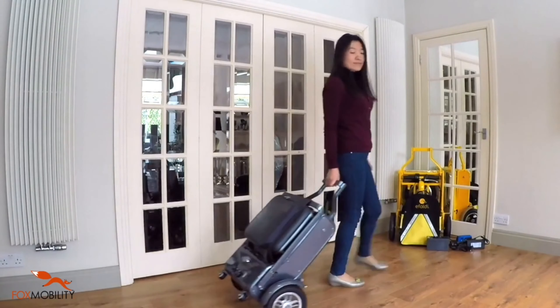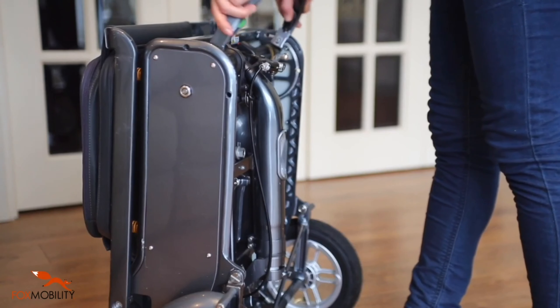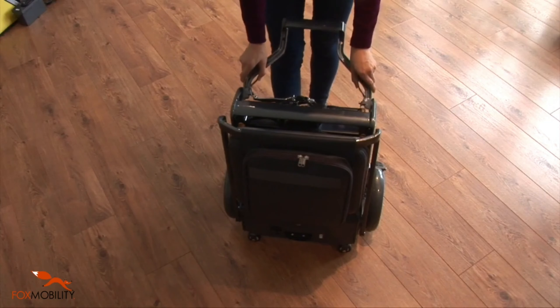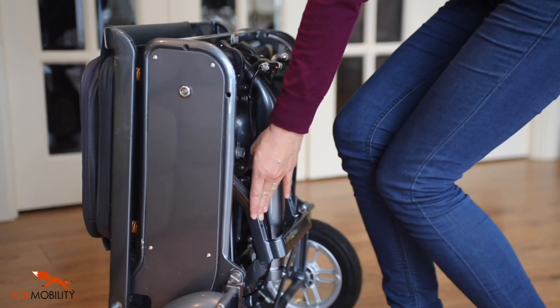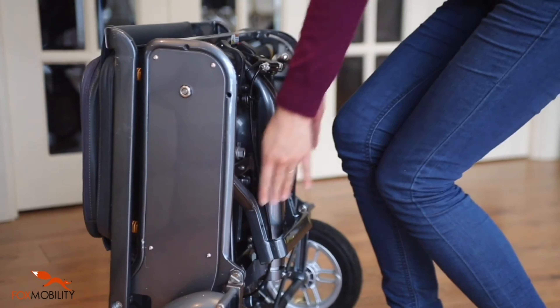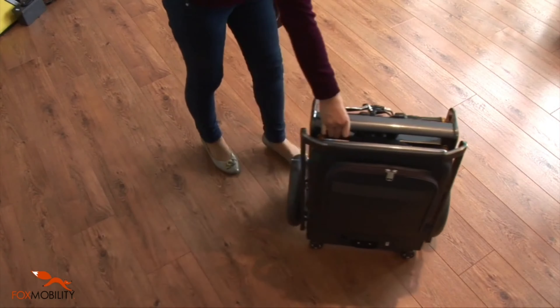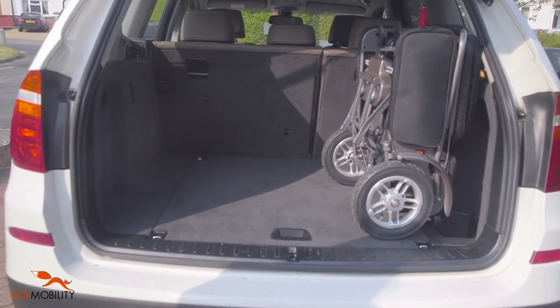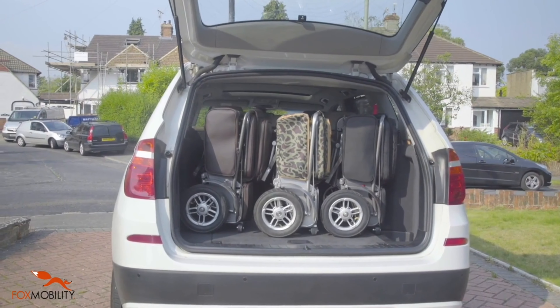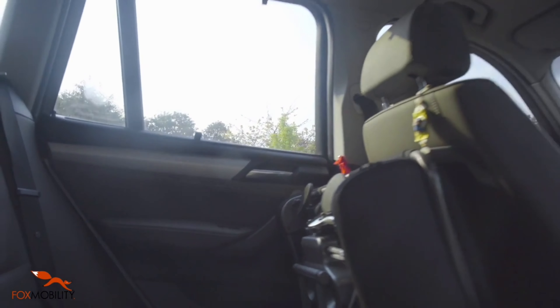Travelling with the eFoldie. For longer journeys, the eFoldie can be easily folded and fit into your car. To do so, release latch B and C on the front stand at the same time, holding them until the front stand is lowered fully and rested against the handlebar assembly. The eFoldie is the size of a medium suitcase and can be neatly packed in the car boot, leaving sufficient space for other luggage. It can also be put in the car on the seat or in the footwell of the passenger seats, with room to spare.